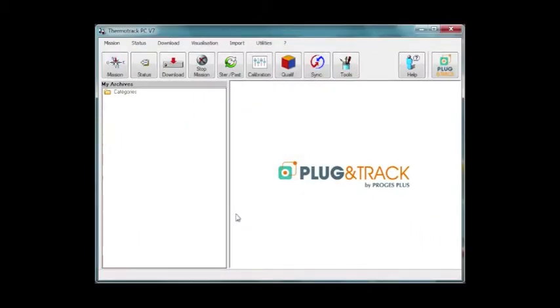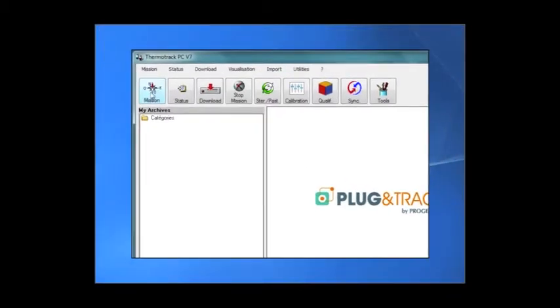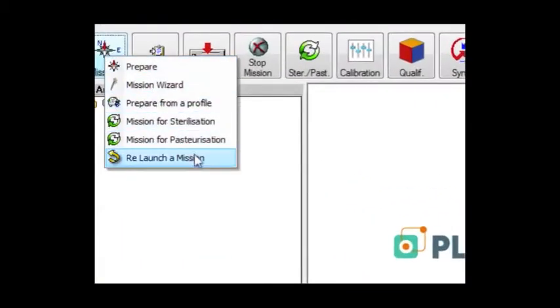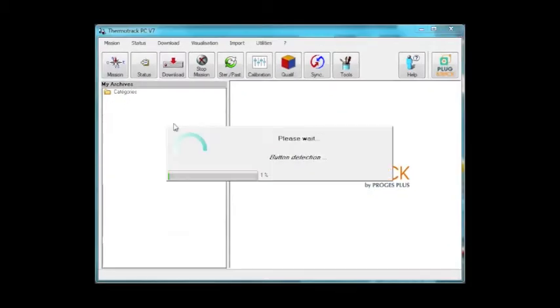The second possibility is to relaunch the mission with the same parameters. Click the mission icon and choose relaunch mission. Place the button on the USB reader.